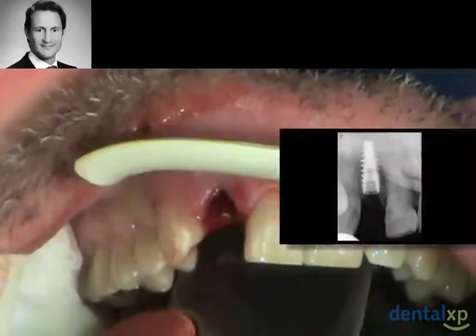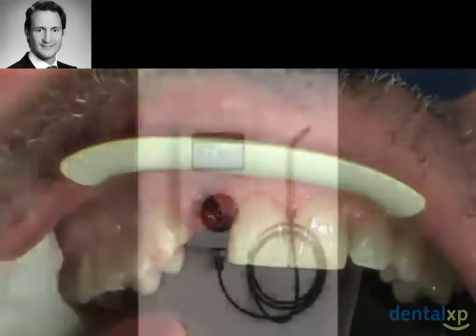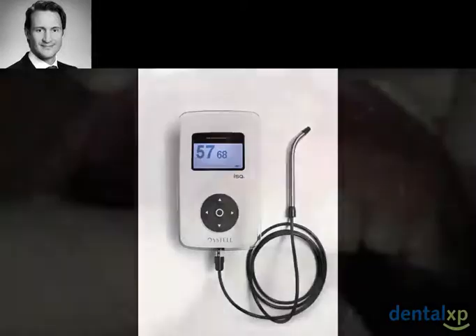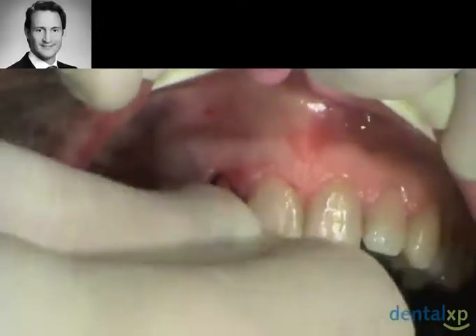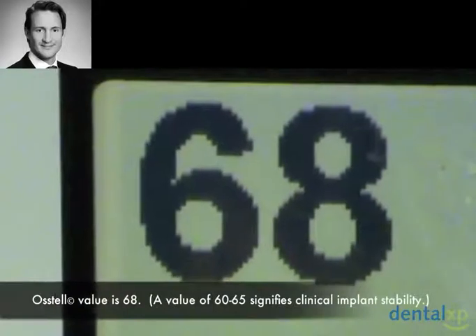A periapical is then utilized to evaluate the implant insertion depth, and an Osstell ISQ device is used to perform Osstell readings. This is the placement of the Osstell peg. In a case such as this, where we achieved approximately 70 Newton centimeters of insertion torque, we would expect there to be a high ISQ value, and in this case the ISQ value was 68, with a value of 60 to 65 signifying clinical implant stability.